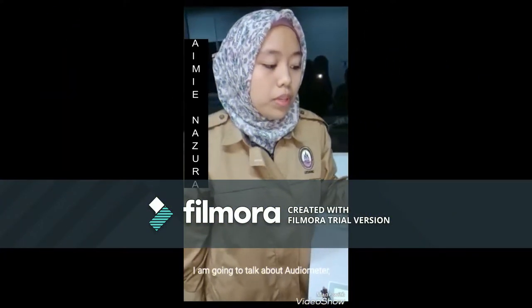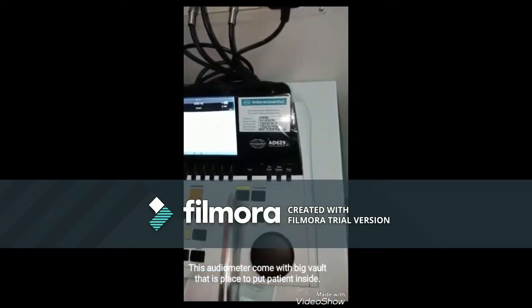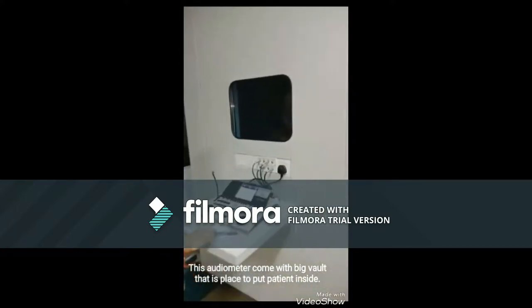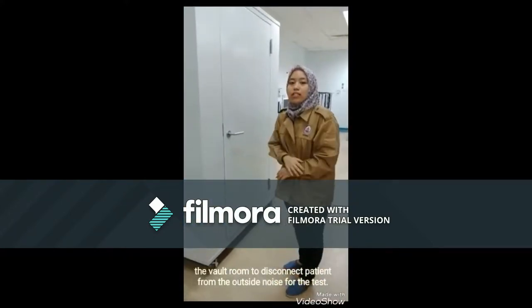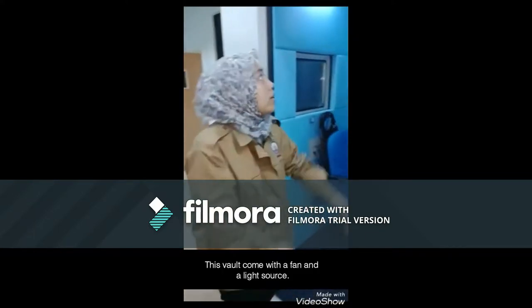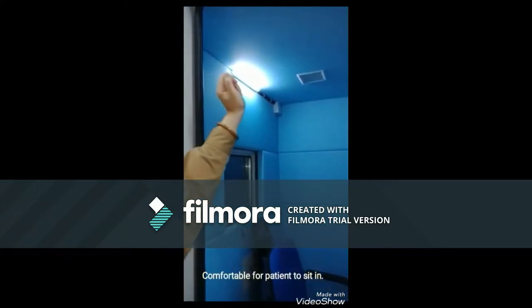To talk about audiometer. That is brand AD629 from Interacoustic. This audiometer comes with a big booth that is to put a patient inside the booth room to disconnect all the outside noise from the test. This booth comes with an air conditioner and a light source for the comfort of the patient to sit.